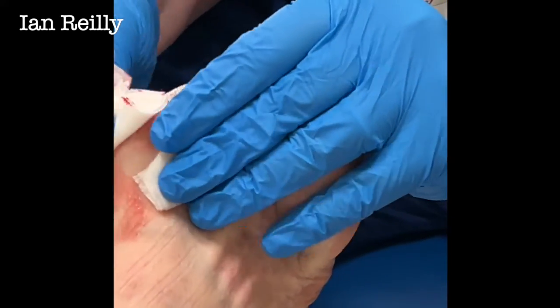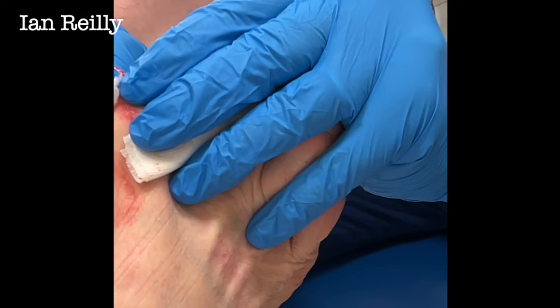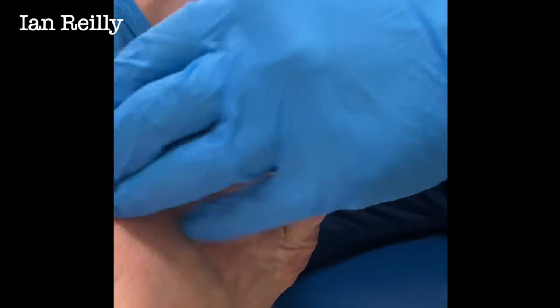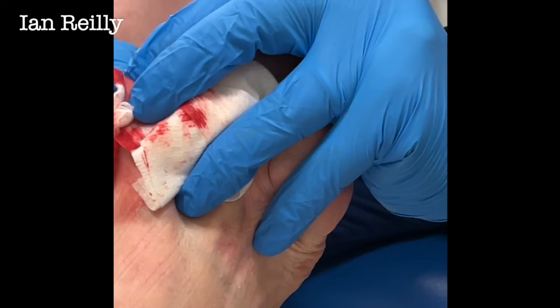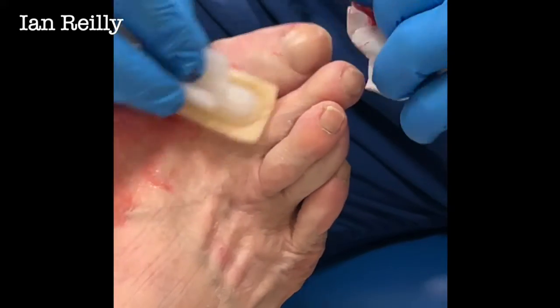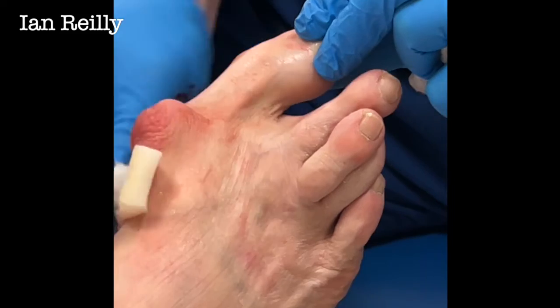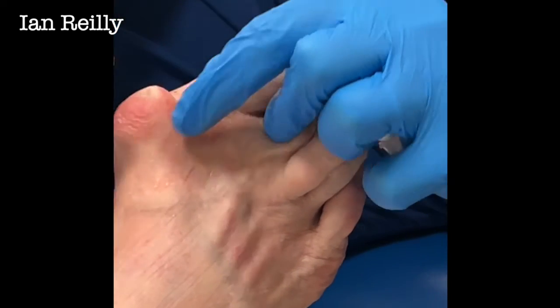Yeah, so actually quite a lot of blood, Alan. I'm not sure if that was me or if it was bruised in — I'll take the blame. I think what's happened: I play a lot of golf and I bought some new golf shoes and they were a little bit on the tight side, so I reckon that might have done it. Have you been playing golf recently? No, I haven't played since November. Okay, well it's not the golf shoes then. What I'm talking about is why there's so much blood in the lesion — I'm not sure whether it was bruised in there or whether that was me from the needle, but I'll take the blame.